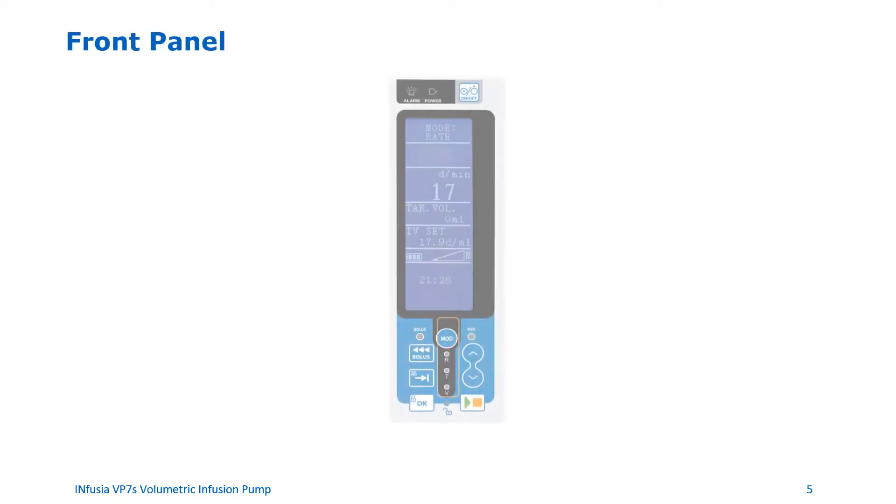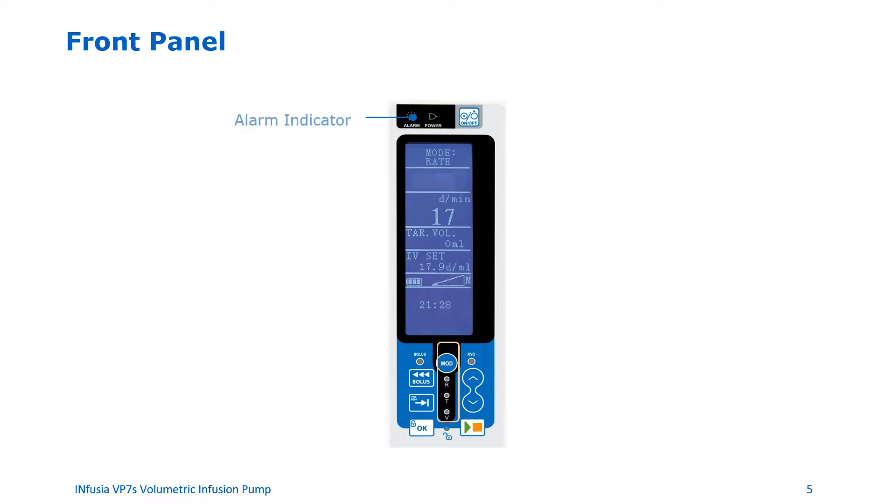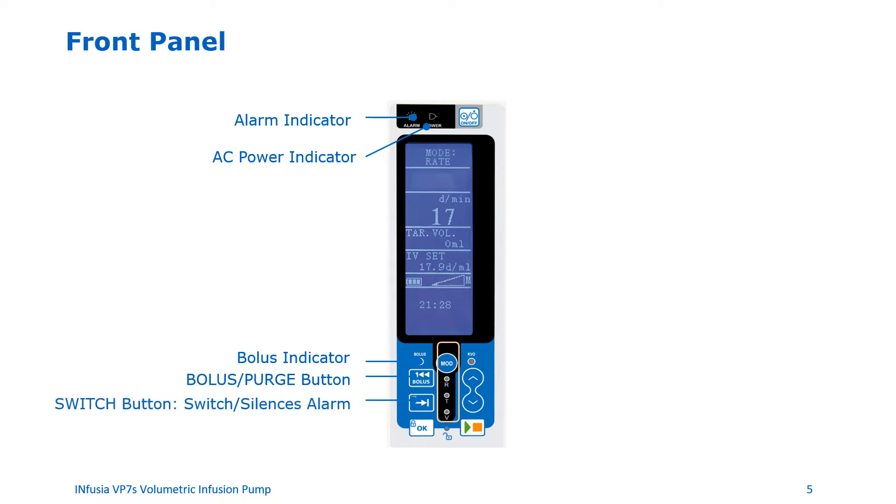Let's familiarize ourselves with the front panel. On the top left there is an alarm indicator which lights up when the pump is alarming. The AC power indicator lights up if the pump is connected to AC power. The bolus indicator shows when the pump is delivering a bolus. You can use the bolus purge button to deliver a bolus to the patient or purge the infusion set. The switch button can be used to switch modes or silence alarms. The OK button is used to confirm a setting or to acknowledge and clear an alarm. The lock button locks and unlocks the keyboard and also serves as a keyboard unlock indicator.